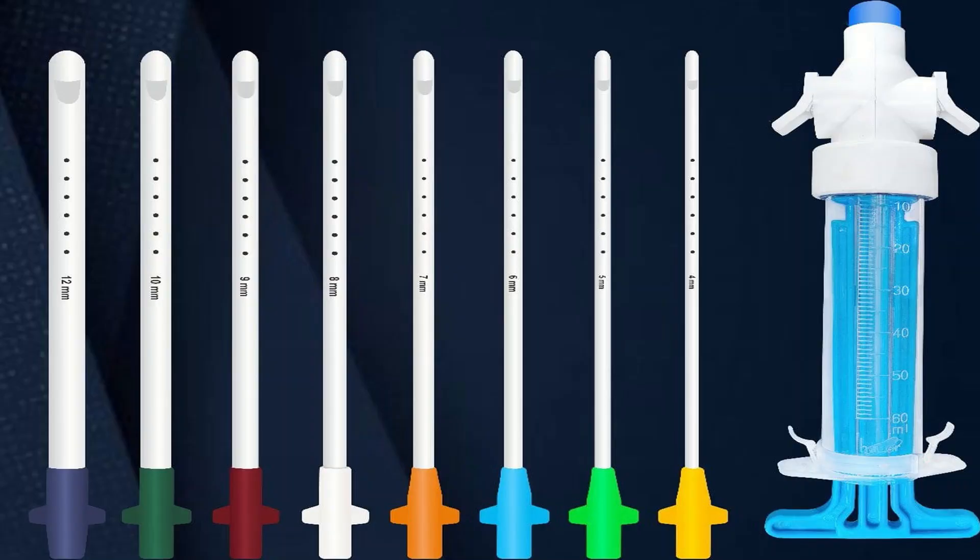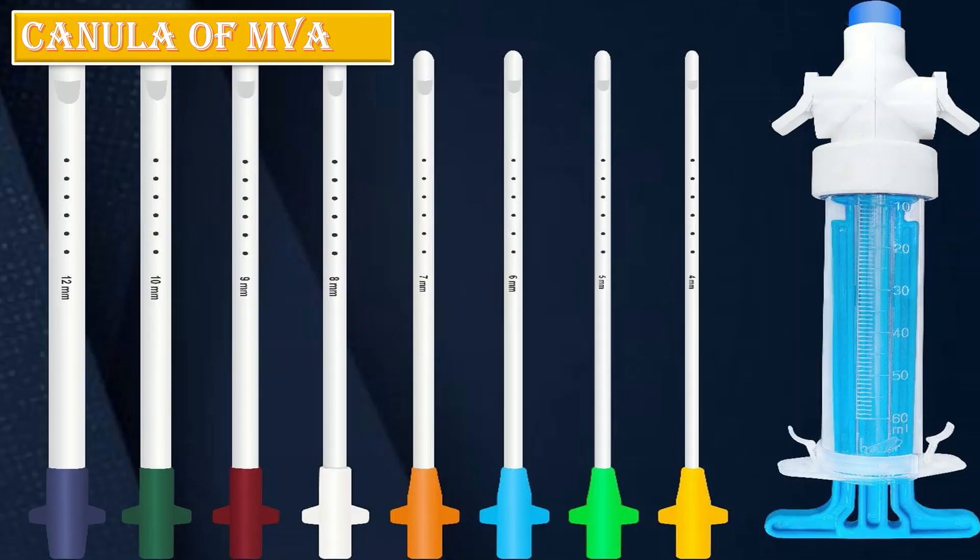The cannulas of MVA are of different sizes in the range of 4mm to 12mm. Cannula number 11 is missing, and you can see the color code here.